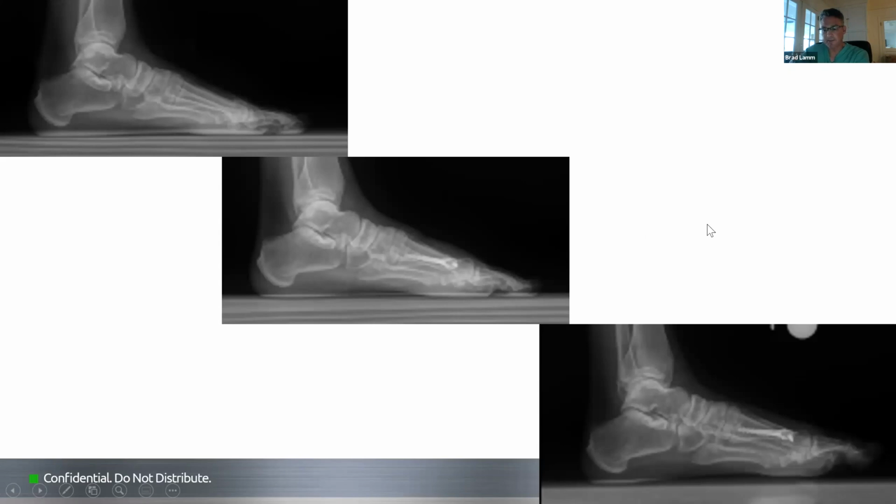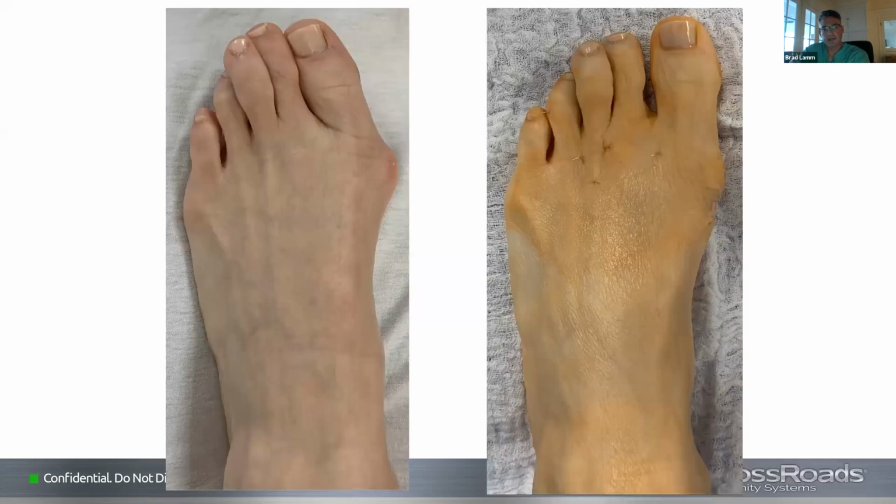Sorry, they're a bit blurry, but they show that the position of the metatarsal head is in good alignment on the lateral. That's really critical when you are looking at the x-rays intraoperatively to align that translation dorsal-plantar. And the Viking guide helps with that because it sits flush with the dorsum of the foot, so you don't get that inadvertent plantar or dorsal translation.